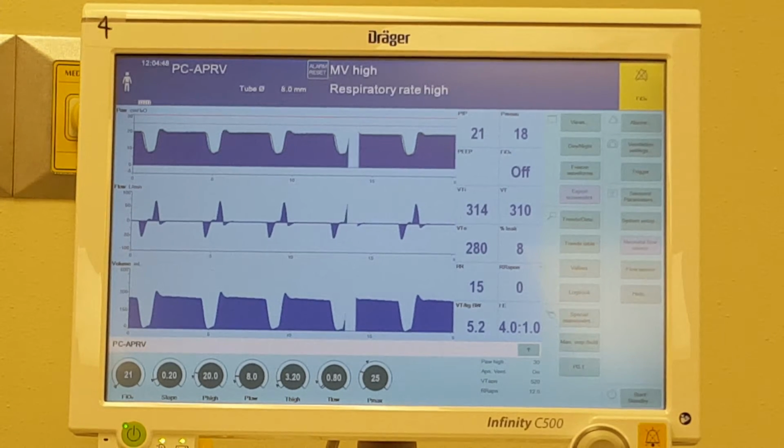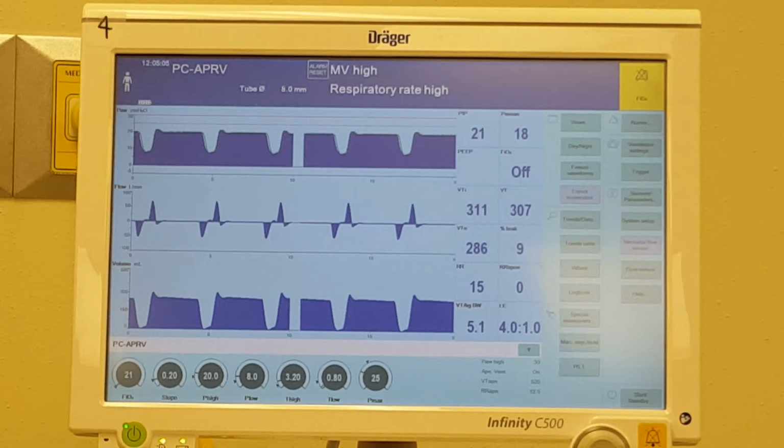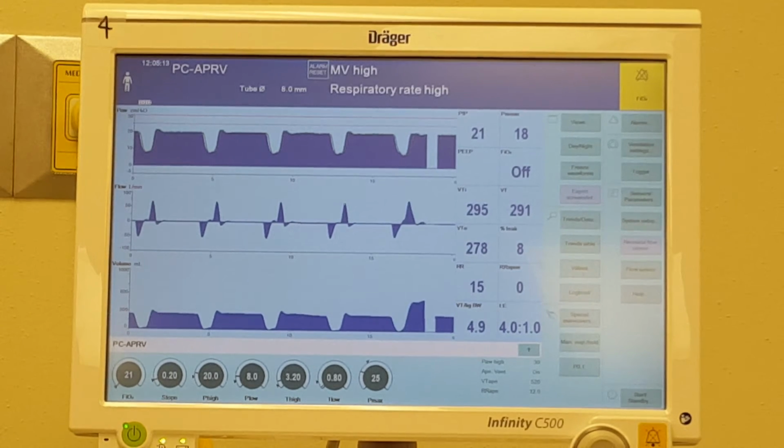All right, the next thing, so take your basal measurements, and the most important thing here, we're in pressure ventilation, so notice our mean is 18, and our tidal volume right around 300. So what's going to happen when we increase compliance to 30, like it says? Well, what would we expect? We're in pressure ventilation, compliance improves. We're expecting an improved volume, right?